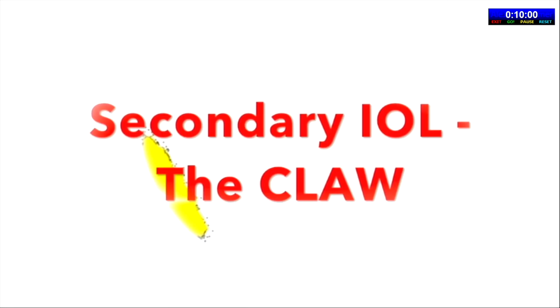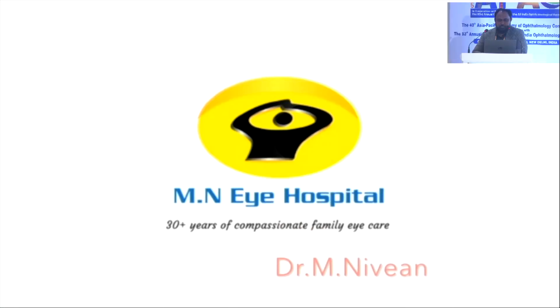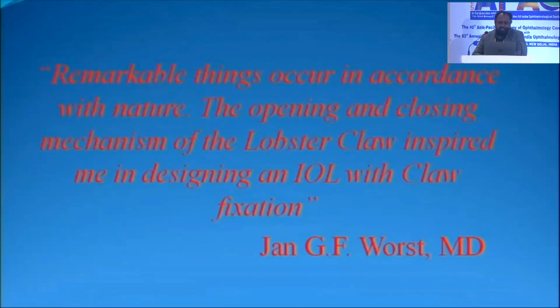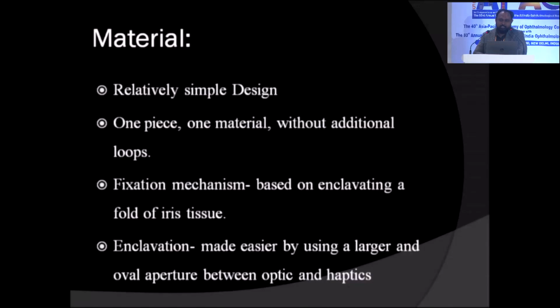So, respected teachers, senior ophthalmologists, my dear friends, I'm going to talk about first the retropupillary iris claw lenses, and then a new innovation, the CMT Flex IOL for aphakia. I already saw a lot of hands raised. These iris claw lenses were invented by Worst. He was inspired by the lobster claw.